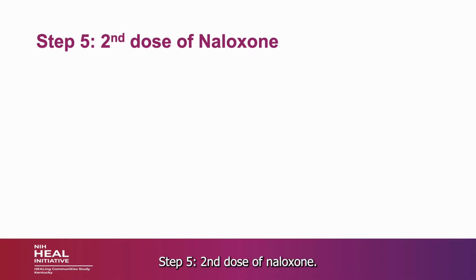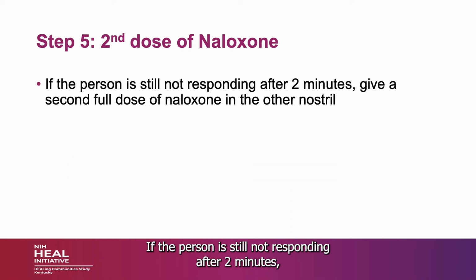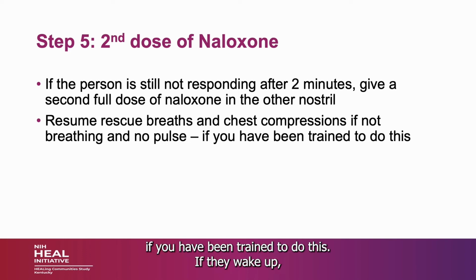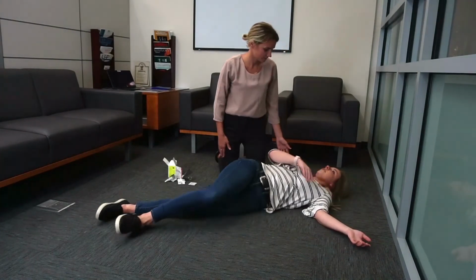Step 5, second dose of naloxone. If the person is still not responding after 2 minutes, give a second full dose of naloxone in the other nostril. Resume rescue breaths and chest compressions if not breathing and no pulse, if you have been trained to do this. If they wake up, try to keep them calm and be happy you just saved a life.